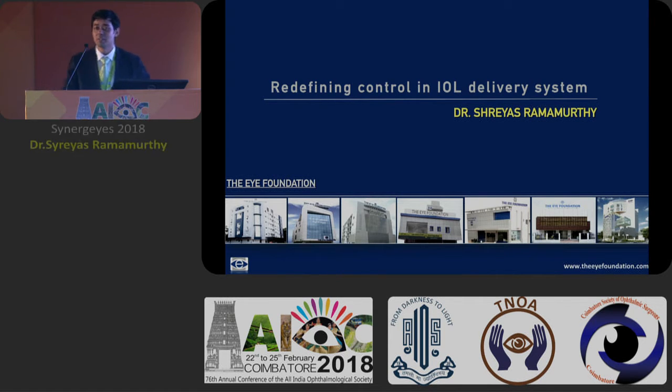So good afternoon, everybody. You all just saw a wonderful exhibition of a very advanced phaco system being used to break down multiple hard cataracts with great ease from Dr. Meena Kumari. When you have done such a beautiful cataract surgery, you have to combine it with an appropriate IOL to give the patient the very best. And when it comes to an intraocular lens, there are certain parameters which we really need to look into for an ideal intraocular lens. The slides are not moving.